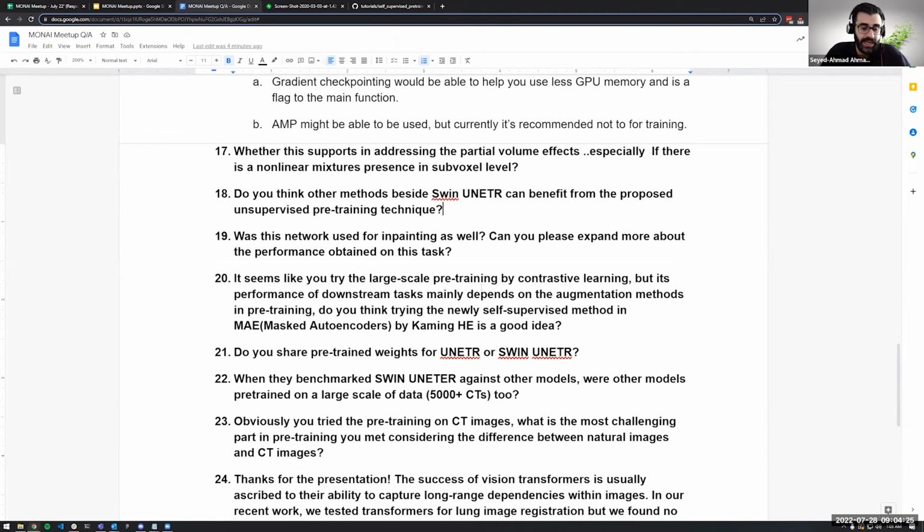So one of the 3 tasks. And it does this, but I have to say that the reconstructions that you get do not look very good. Yeah, and I think that's also not that important for the pretext task of in-painting, especially because it is one of the shared 3 tasks, and they are weighted equally. So the contrastive learning, the rotation classification, and the in-painting are weighted equally. So the reconstructions that you get are not looking that great, but it's enough to train a pretty strong encoder branch.